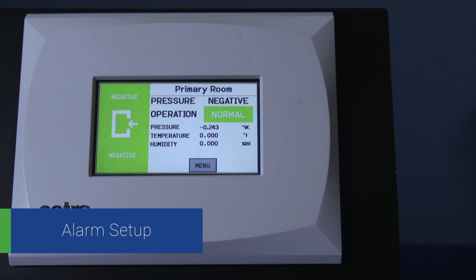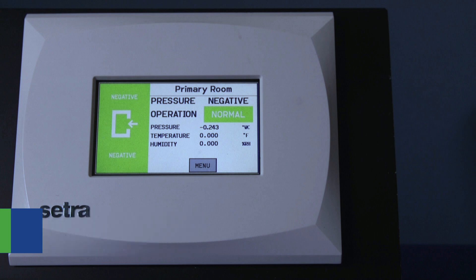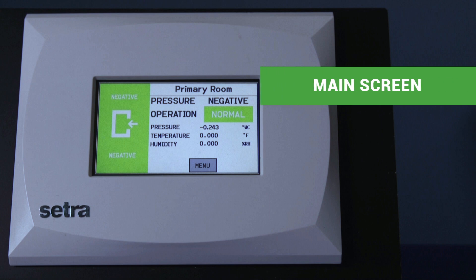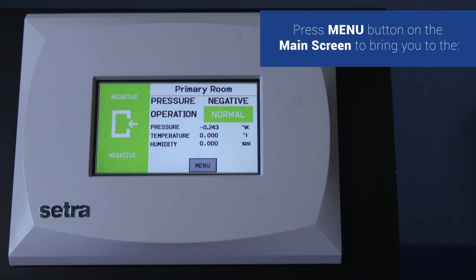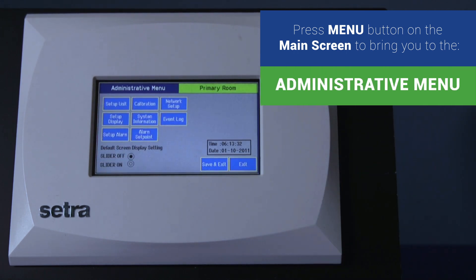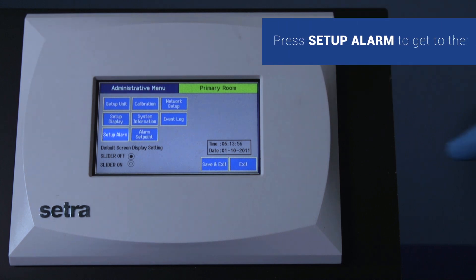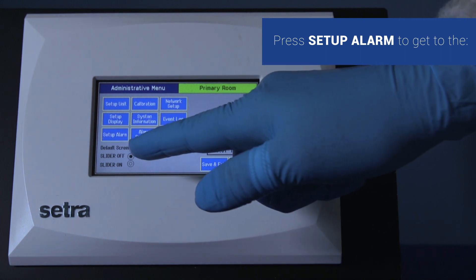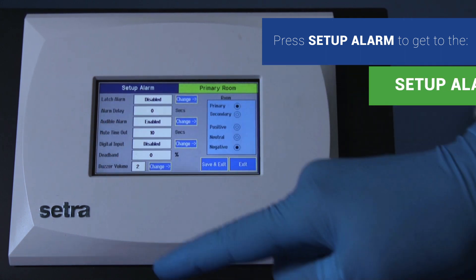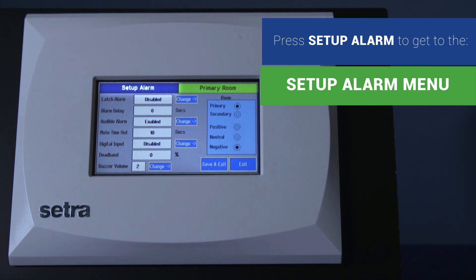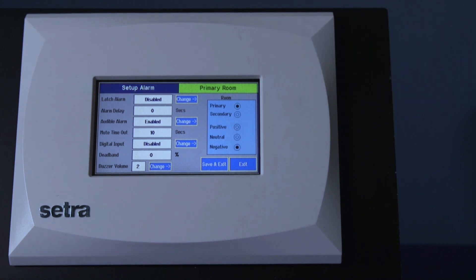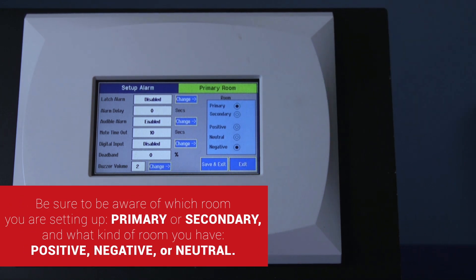Alarm setup. This is the main screen. Press menu to get to the administrative menu screen. This is the administrative menu. Press setup alarm to get to the setup alarm screen. Be sure to be aware of which room you are setting up — primary or secondary room — and what kind of pressure — positive, neutral, or negative — that you have.